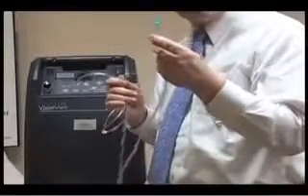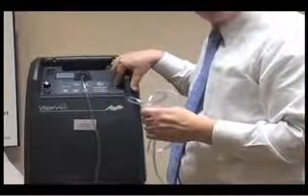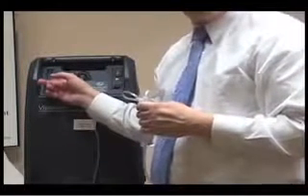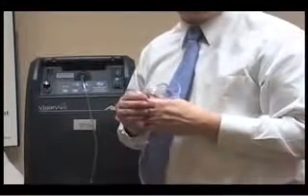Remember that the end of the nasal cannula should be placed nice and snug in the port on the oxygen concentrator. Make sure that the machine is in the on position. There's a little ball in the liter flow that will tell you exactly how much oxygen you are receiving.